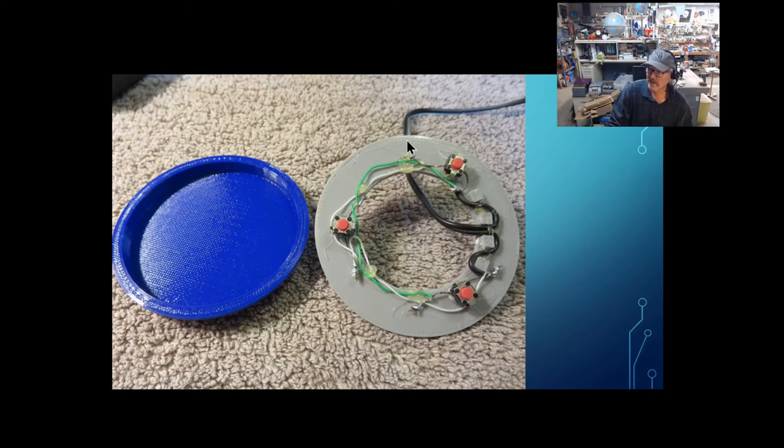Now, you want to try to keep things away from this outer rim right here, because that is where the rim of this button resides. There's a little space there, so you don't have to be so careful, but there's a lot of space in the middle here that you don't use, and all the wires can be in the middle.